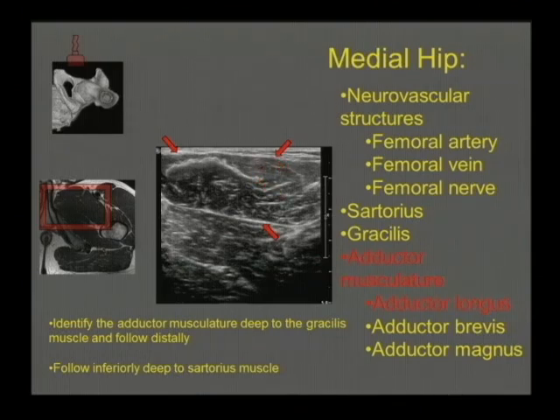It's important in its own right, but it also has an aponeurotic plate that it shares with the rectus abdominis muscle. So if there are symptoms being described as athletic pubalgia, you certainly want to evaluate the proximal extent of this muscle, where it originates from the pubic bone superiorly into the rectus abdominis, and see if the symptoms are referable to that area and if there's any disruption of its fascia or the muscle itself.